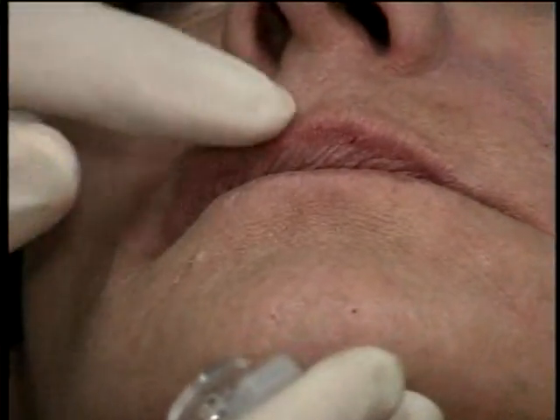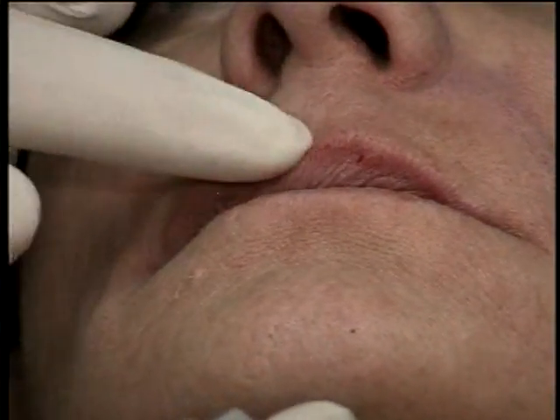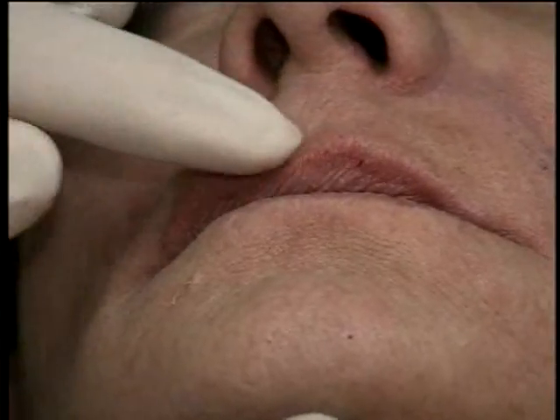And I palpate the lip to see if I missed any areas, because if you do, it'll become obvious afterwards.